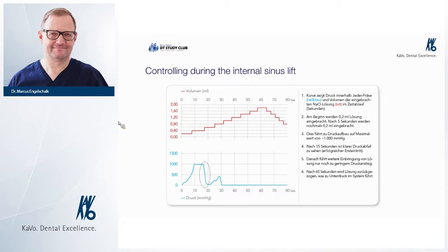The same, the bone shrinks more and more after extraction because before extraction we had the periodontal problems. Bone shrinks, bone disappears, extraction, there's more bone to lose, and then we will bring in the implant, and you see the hill-shaped augmentation.